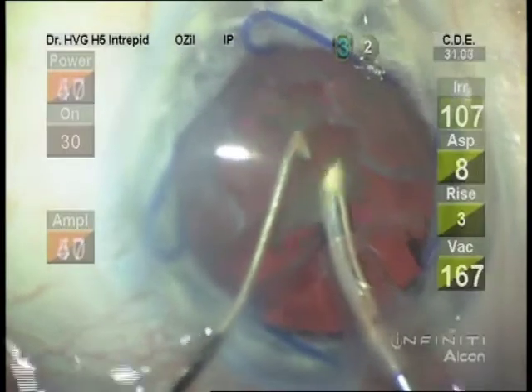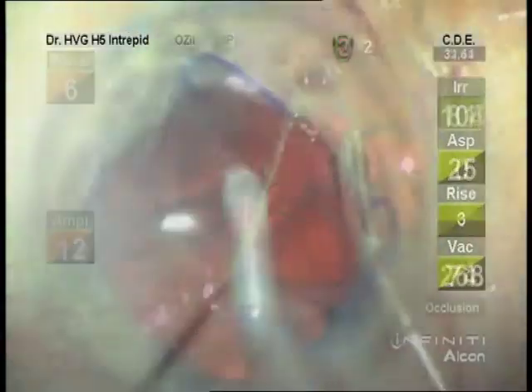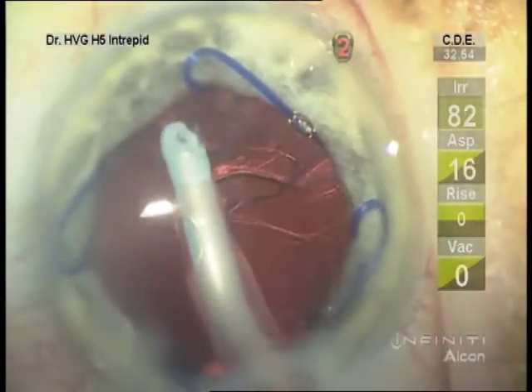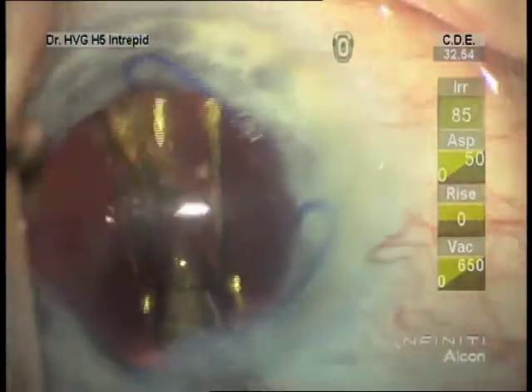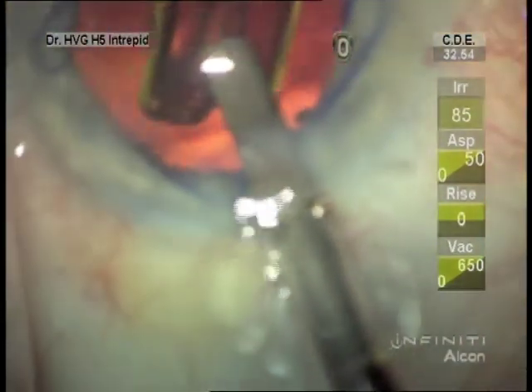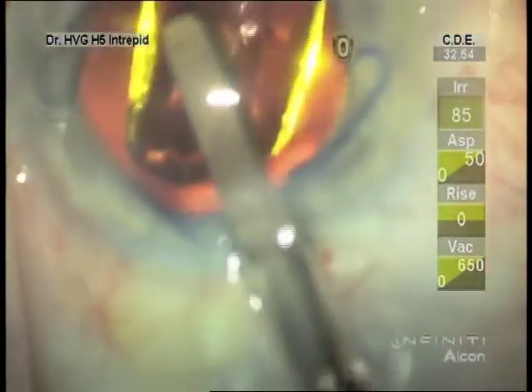There are a number of different devices. I do like this Malyugin ring if possible because we don't need a number of paracentesis ports. It gives a widely dilated pupil.